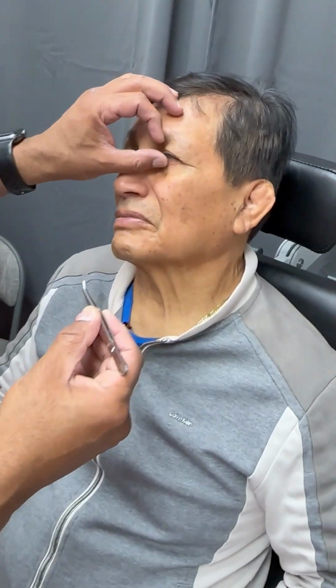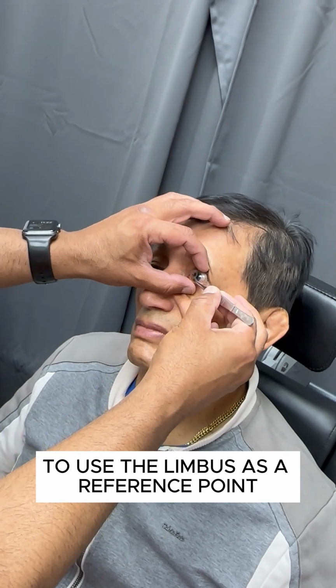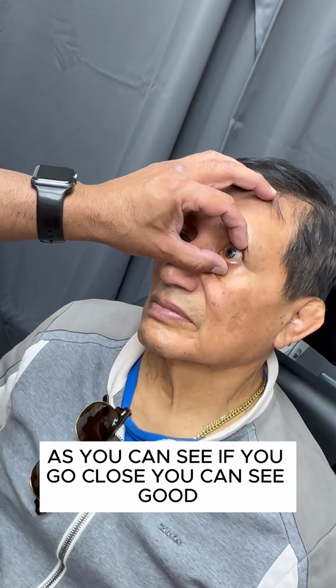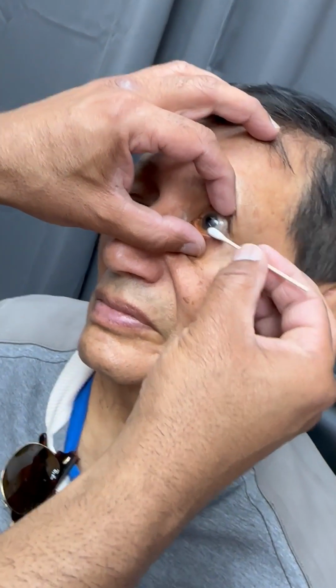You want to come nice and close? Mira aquí a mi ojo. Now normally when you do an amniotic graft, you use the limbus as a reference point. Here we're using the pupil as a reference point and trying to center it well over the pupil. As you can see, if you go close, you can see good. Now we're just smoothing out.